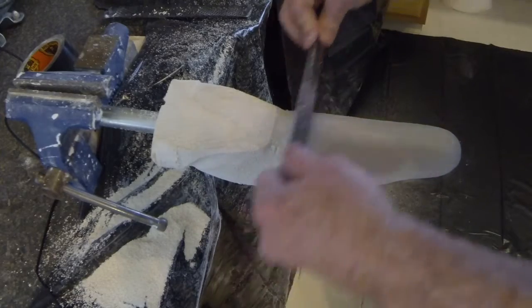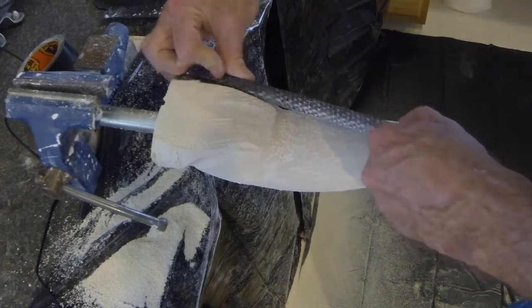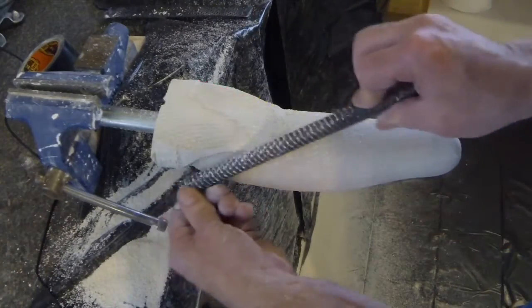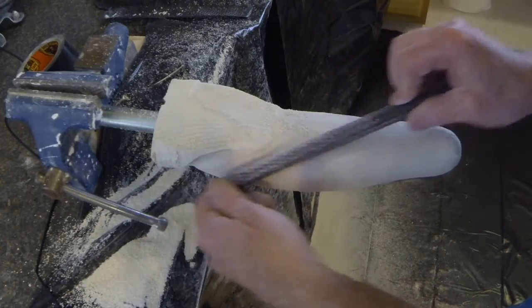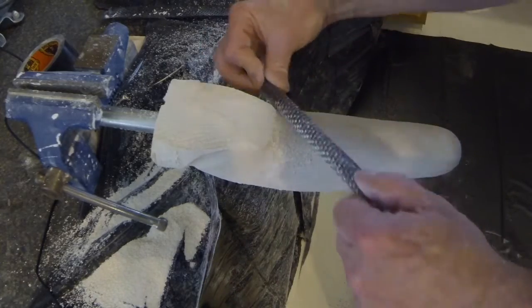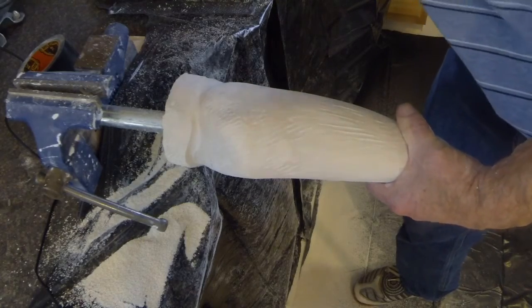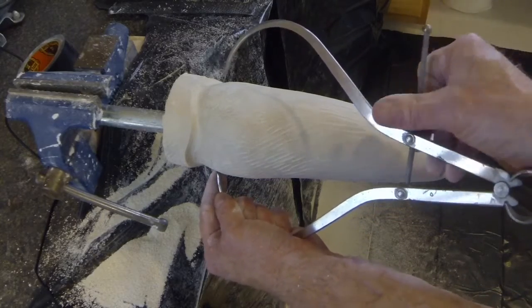A round file is used to continue shaping the anterior wall. Again, a gentle U-shape is desired. Recheck the proximal ML and continue to bring this dimension to the desired value.